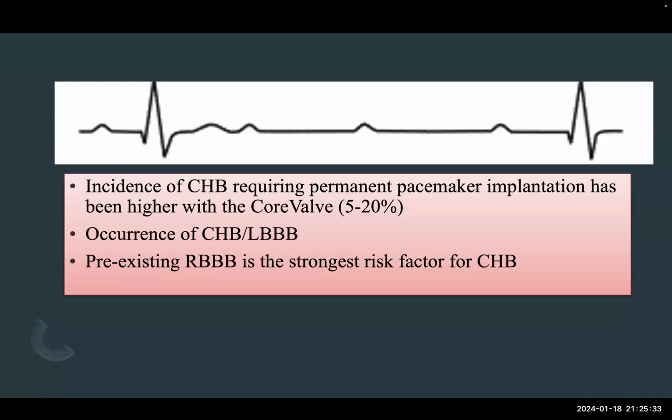Let's say post balloon, he has gone home and he came back with paravalvular leak at follow-up. If it is more than mild, we need to close it. We need to do it by endovascular approach. So we do a plug.